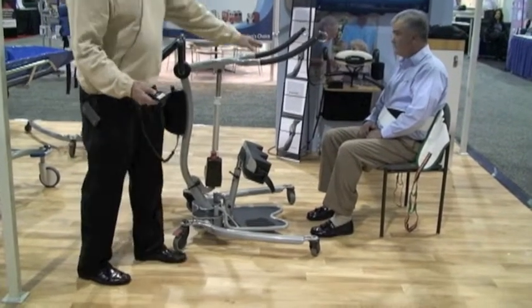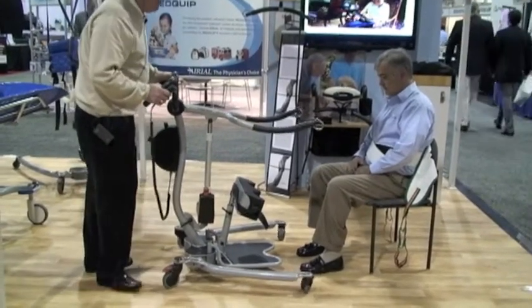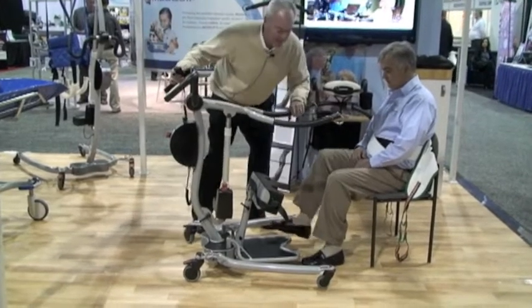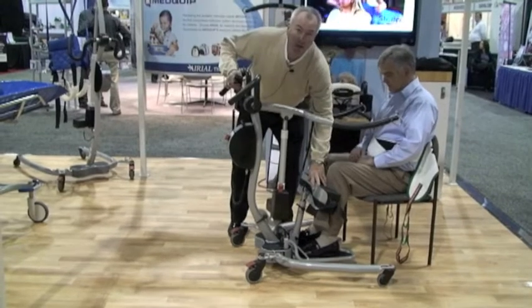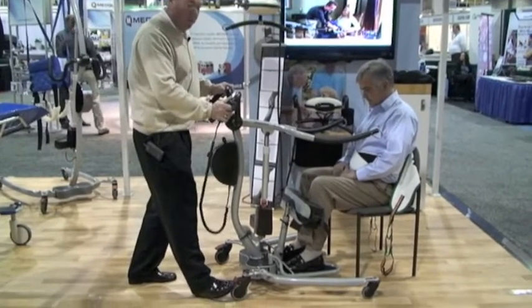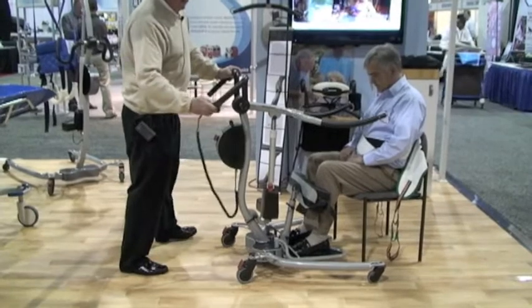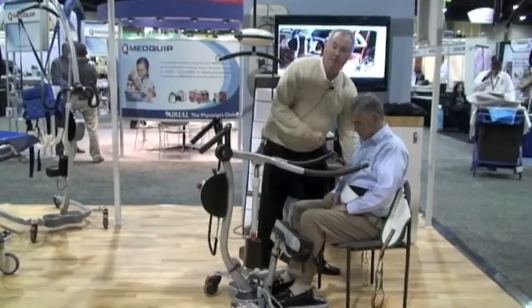I also want to lower this down to his chest area and bring it over to the patient. I'm going to ask the patient to put their feet up onto the pad, then bring this up to his knees — this is at a good working position with the knee pads. There are brakes, and whenever we go to pick up a patient, you want to lock the brakes. I'm going to lower this down and apply the sling.